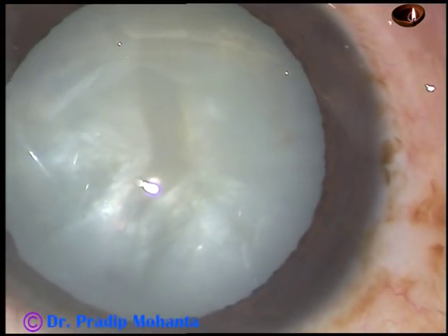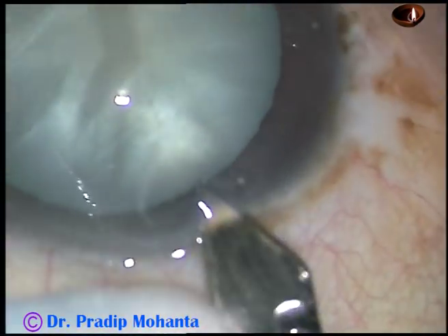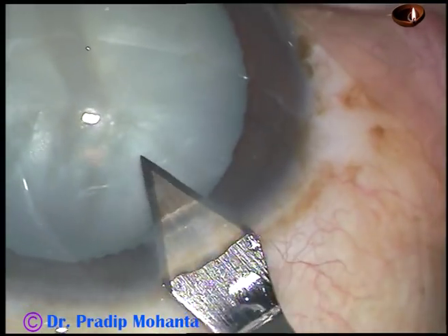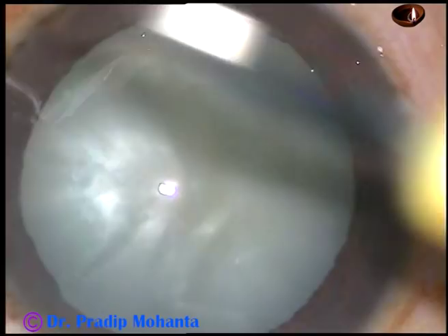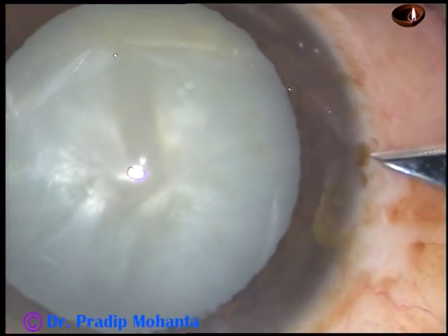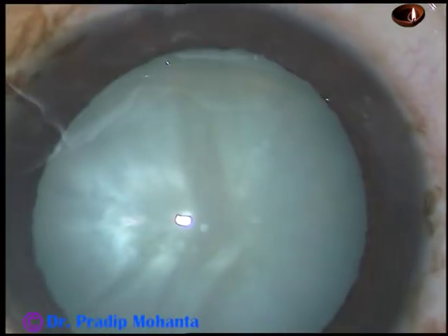This is the main incision with a 2.8 mm keratome at around 11 o'clock. And now this is a paracentesis on the right side of the main incision, about 2.5 clock hours away.